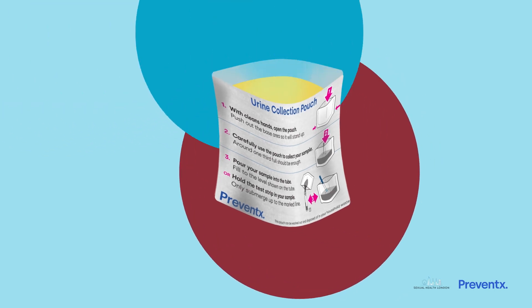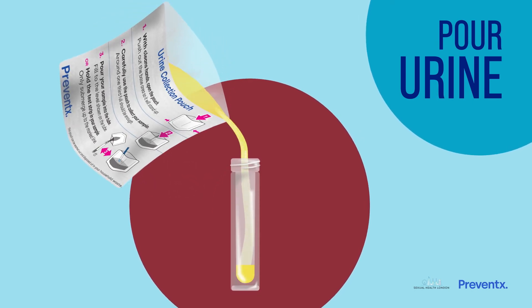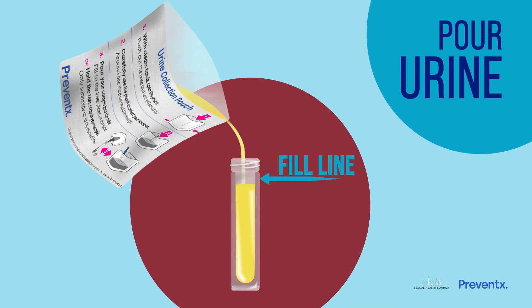When you are finished, carefully pour your urine into the tube like this. It needs to fill at least half of the tube and you can fill it up to the line shown.